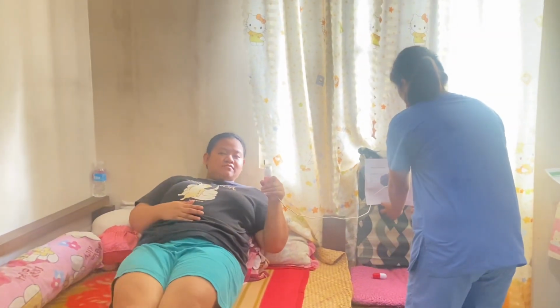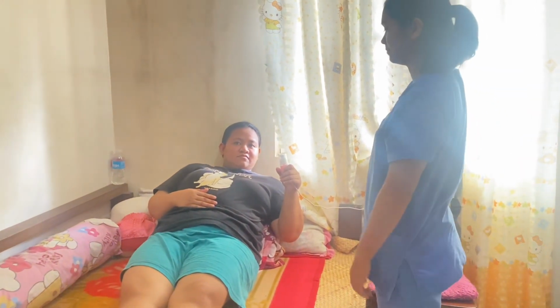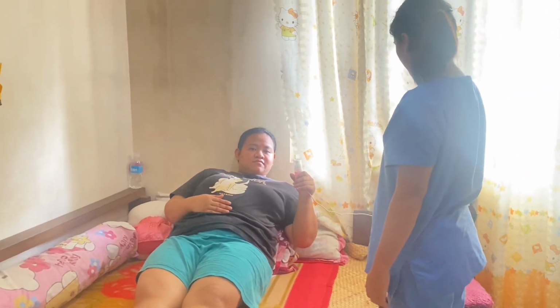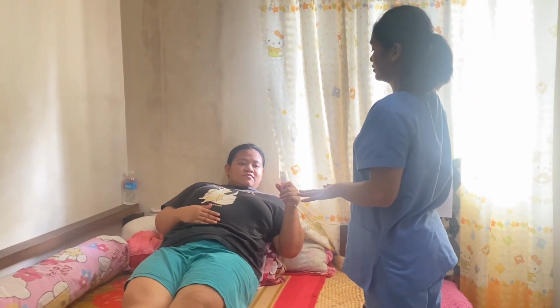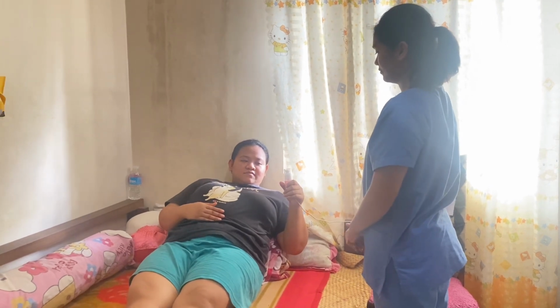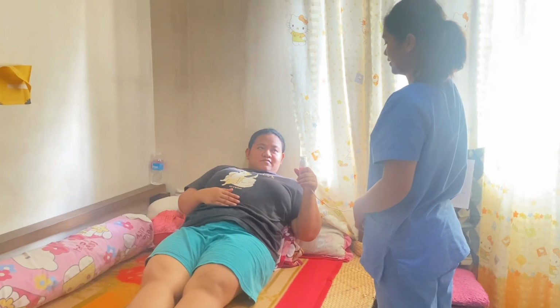A face mask is used for a child, an infant, or an adult who is fatigued or who is unable to follow instruction. Use special adapters for client with tracheostomy. Also ask the client to take deep breaths slowly to a volume slightly. And also teach the client the breathing pattern.